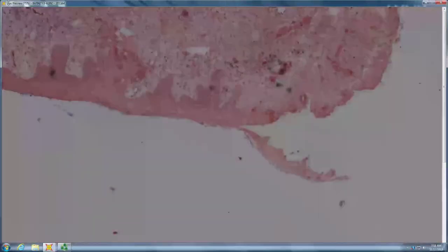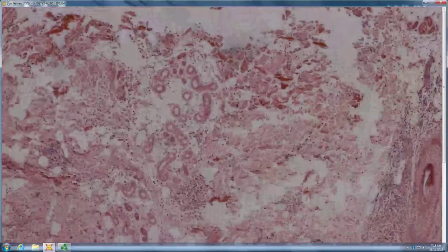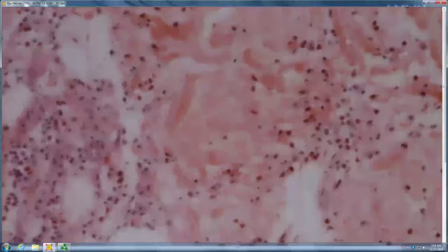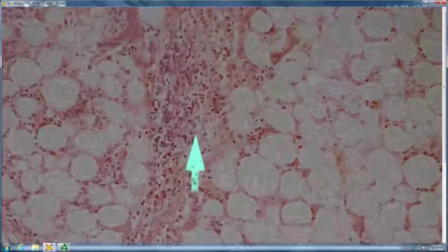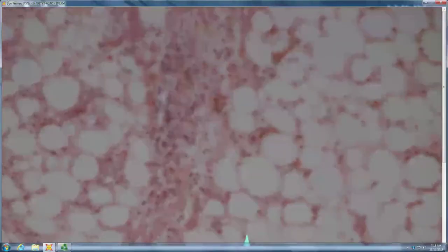So, looks like maybe more of, there's eosinophils, there's infiltrate kind of deep. Yeah, so mainly eosinophils and lymphs, right? Superficial. So it makes me think of maybe like the eosinophilic panniculitis, since there's so many of them. So you're definitely in an eosinophilic panniculitis spectrum.